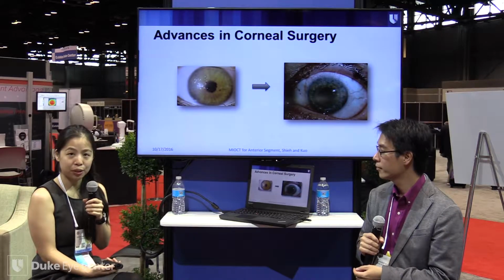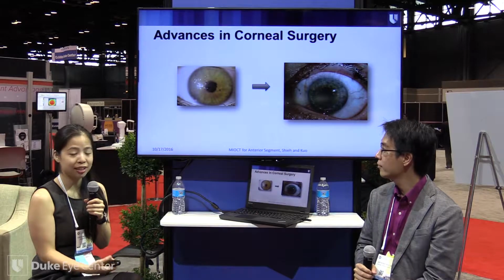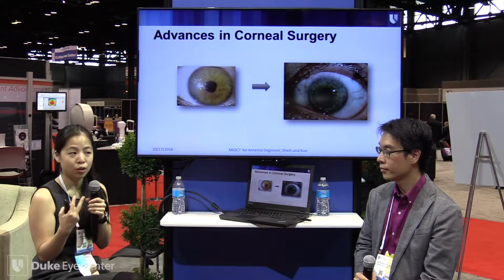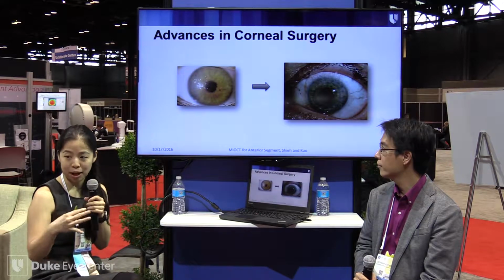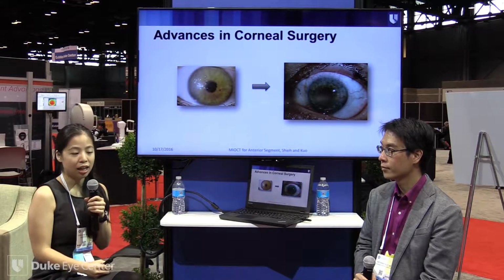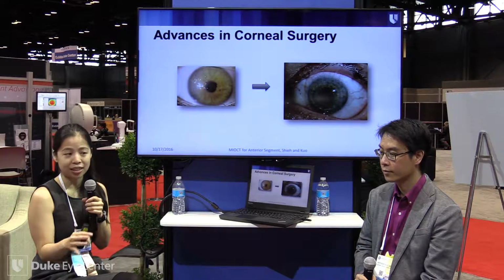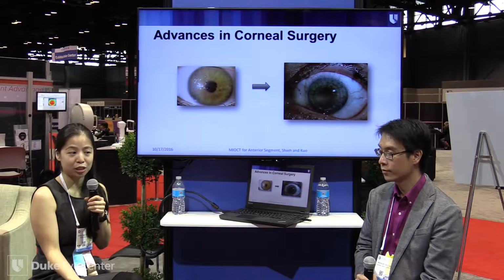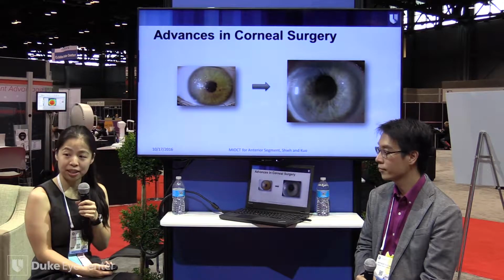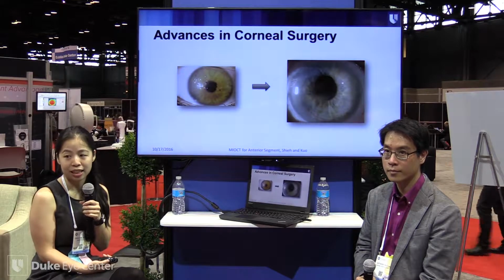Now, historically, it was one solution fits all for any corneal disease. For the corneal surgeon, it didn't matter whether there was a scar in the anterior stroma, corneal ectasia or instability in the biomechanics of the cornea, or endothelial disease, those pump cells that line the cornea. It was PK or penetrating keratoplasty for all, a full thickness cornea transplant no matter where the area of disease was.